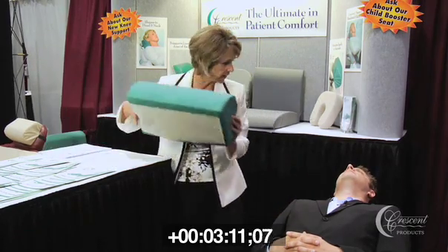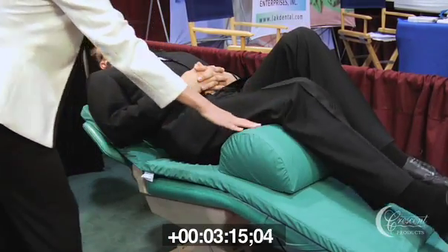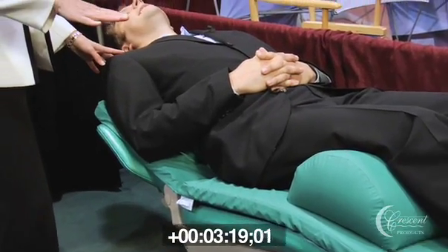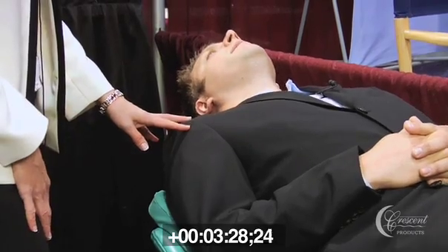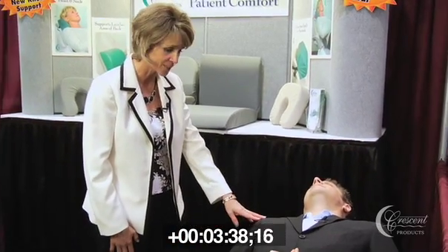Another item that I like to put in would be our knee support, if you can bring your knees up. What this will do is take additional pressure off the back and your hip area. You're in a much more natural position when the knees are elevated, and that's why you'll often see your patients bring their knees up. It's a much more comfortable position for them. Right. What did you think when I put the knee support in? This is much more, I mean, it feels like I could actually sit here for a long time. Absolutely. They really help relieve all the pressure points, and they're great for the doctors and the hygienists too because they have a better angle when you're more properly positioned.